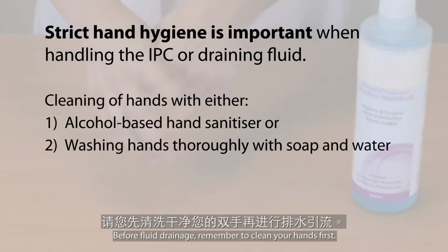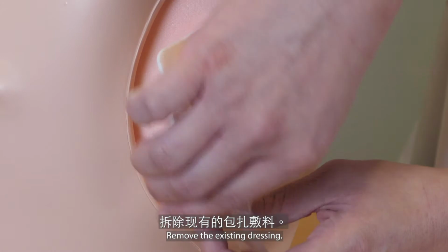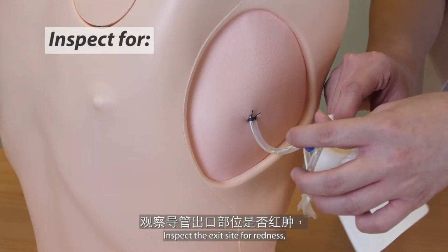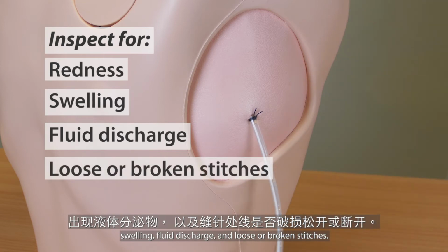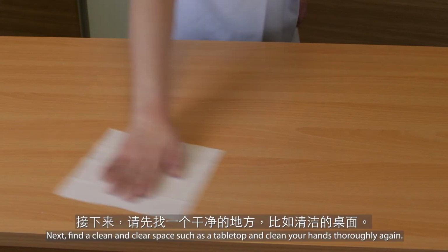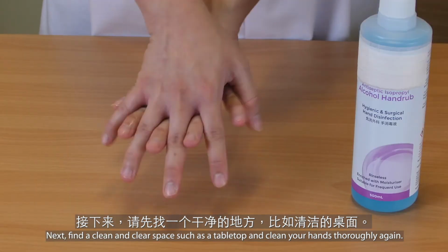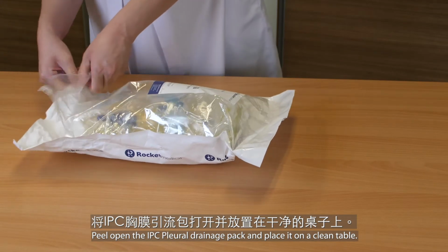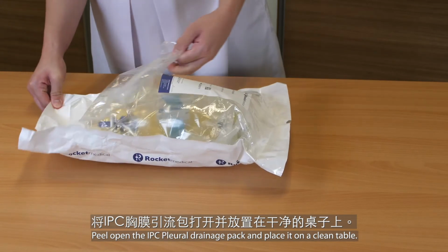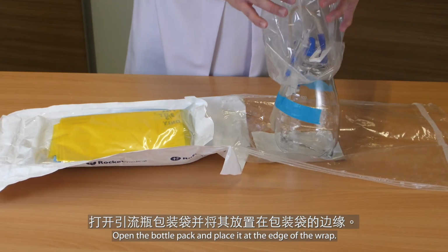Before fluid drainage, remember to clean your hands first. Remove the existing dressing, inspect the exit site for redness, swelling, fluid discharge, and loose or broken stitches. Next, find a clean and clear space such as a tabletop and clean your hands thoroughly again. Peel open the IPC pleural drainage pack and place it on the clean table. Open the bottle pack and place it at the edge of the wrap.